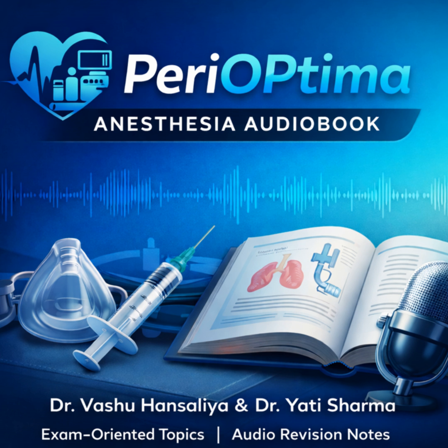When the cuff is inflated with the correct volume, the device should rise slightly out of the hypopharynx, and that signals proper seating. Now, let's tabulate these crucial advantages that examiners are looking for, the reasons why we would use an LMA instead of a face mask or an ETT. Compared to the face mask, the LMA offers significantly more secure and reliable ventilation.